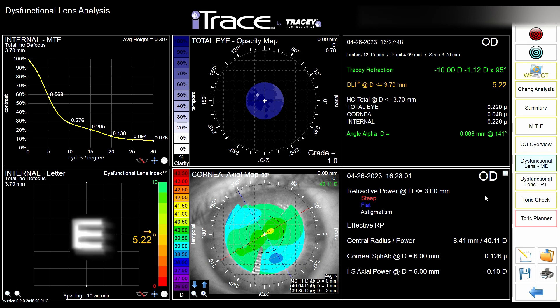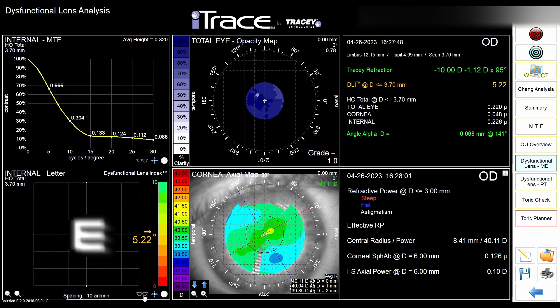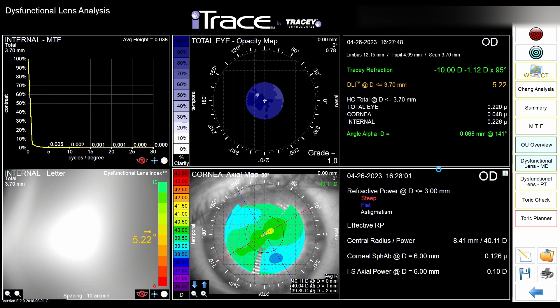What is unique to this machine is the Dysfunctional Lens Index — an objective way of measuring the optical state of the lens. Ten is the highest, like a newborn lens, and zero is like a super dense cataract. This patient has 5.2, which is in the middle. He asked whether he was a candidate for laser or phakic IOL, but opacities were visible on the opacity map, and we suggested clear lens exchange instead rather than phakic IOL or laser treatment.